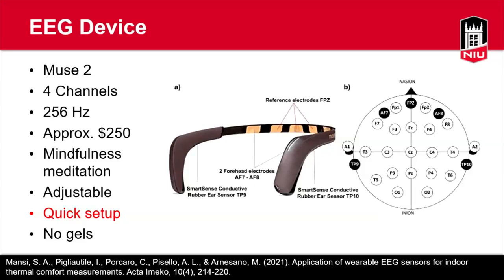So why did we choose this device? As you can estimate, autistic children are sometimes very scared of putting something on. So we need very immediate access to the device with minimal interruption, stress, and frustration. We've been doing a pilot study and main data collection. There are some challenges, but it's still doable, so we are happy with this device setup.